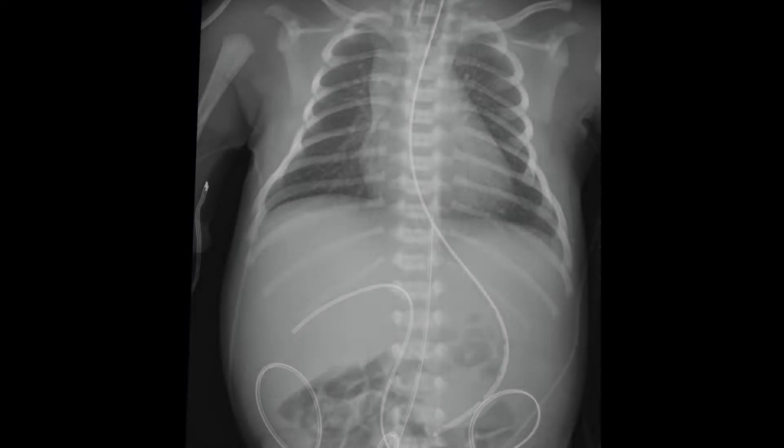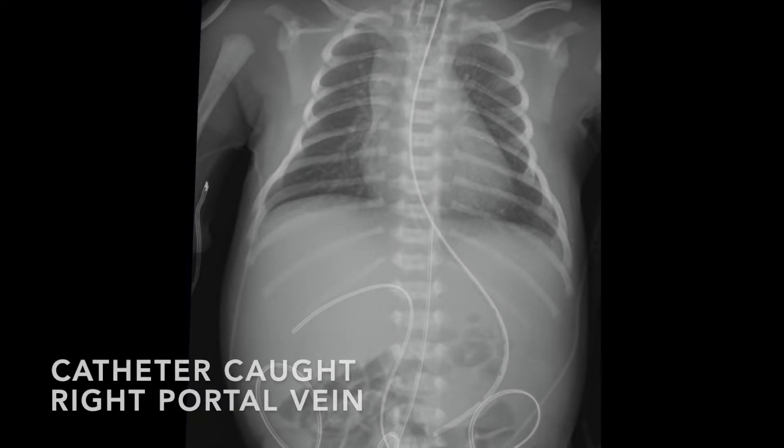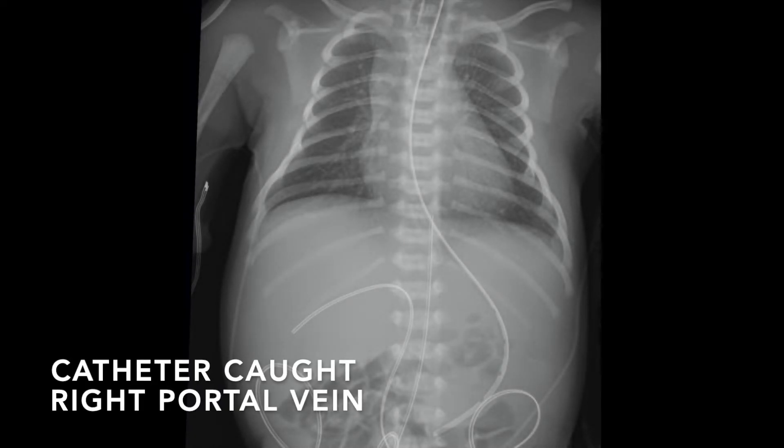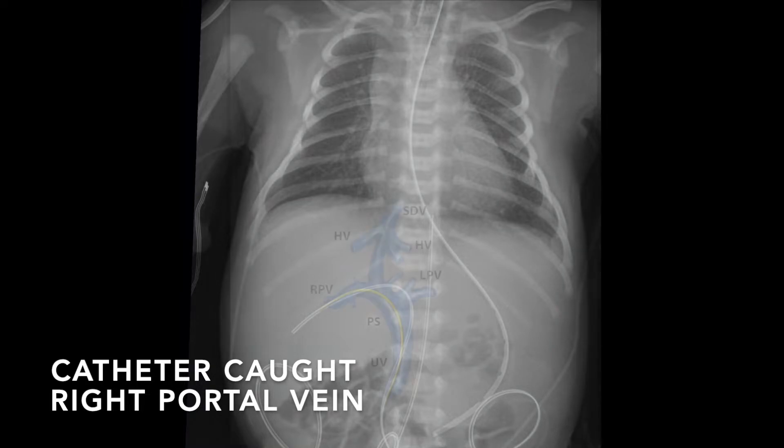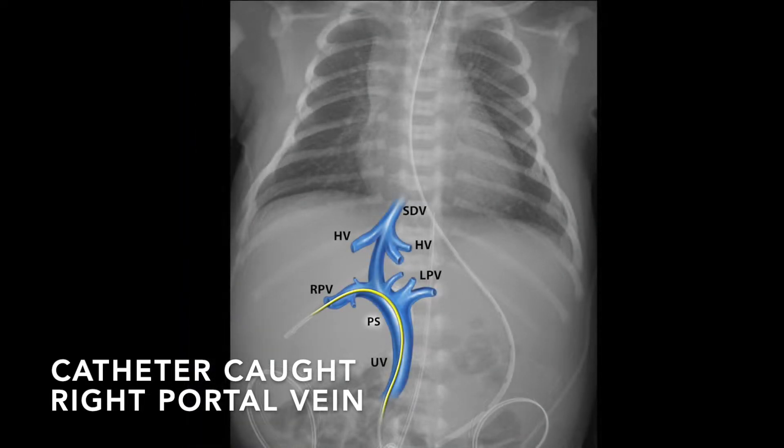We will now look at catheters caught in the right portal veins, as shown in this radiograph and overlaid illustration.